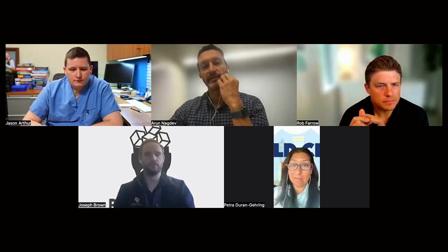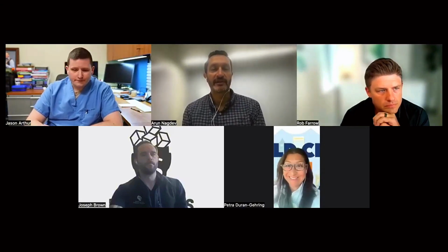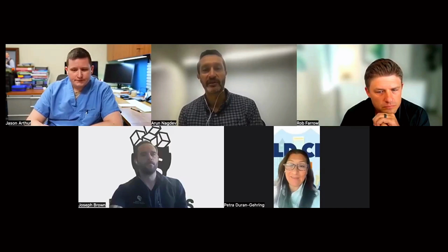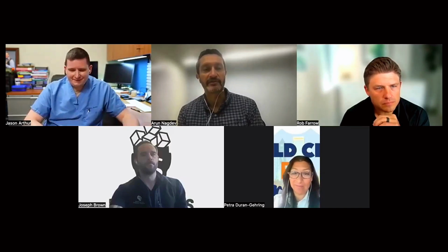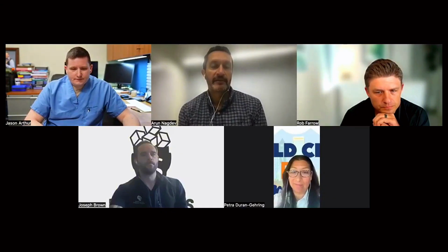Yeah, this is a constant conversation. I think the answer is there isn't a number, but I know that people want a number. So I think the number can be as little as 5, and I mean that honestly. If you do 5 fascia iliaca blocks, I think you're probably good to go. If you're at 10, you're probably pretty good. Again, I've had some learners who've done 10 who are terrible, and you've had them too. You've had your resident who can't get a needle in plane who's been doing this for 3 years. So I think it's just part of the deal. We're going to put some number down, the same way that ASA put down 50 or 25, but that number is going to vary based on the person and their skill level.